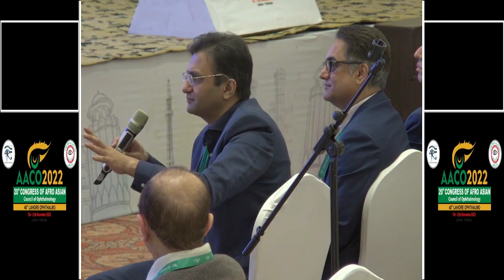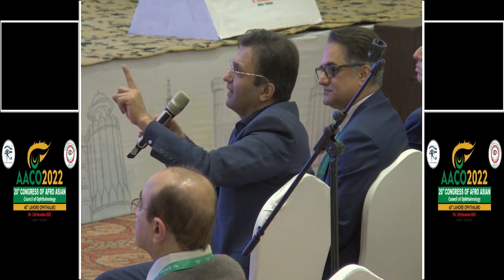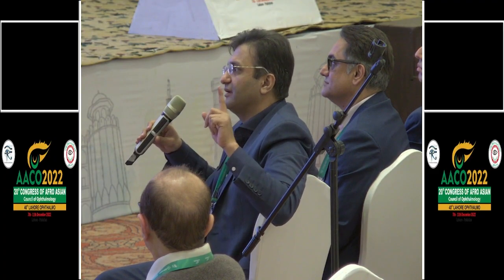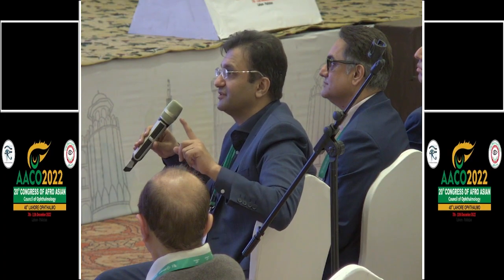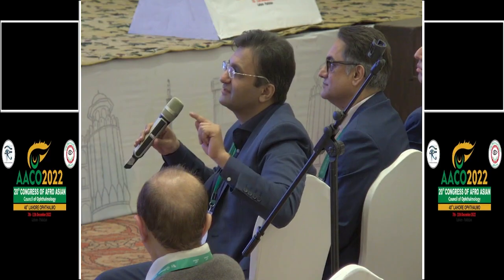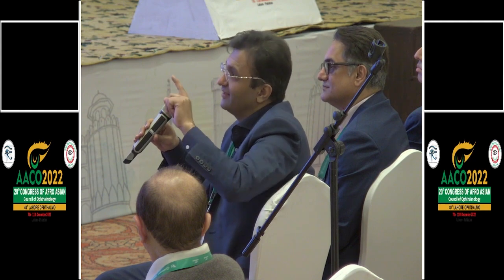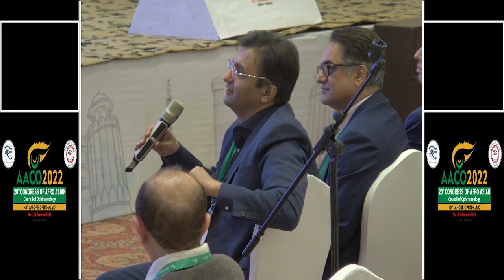And use the software so that you can achieve the full trend analysis. And one more thing, in Pakistan, due to dust, the OCT machines' sensitivity decreases very quickly. Within 1 year, if you do not get your service done, the sensitivity of the machine will reduce by 30 to 40% because of atmospheric dust. And this is why your segmentation errors will increase. So please have the servicing done regularly.